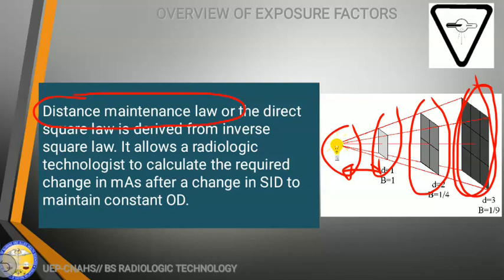So, therefore, para hindi masyadong maitim yung radiograph, a-apply na natin si distance maintenance law, which means we are going to reduce the mAs to compensate the intensity kasi nga malapit siya masyado. So, we are going to reduce the mAs para hindi sunog. Okay? So, para lighter din naman yung image. Nakuha po yung application ng inverse square law at saka distance maintenance law. Sige, so you can raise your question din naman through our different platforms if you have time. So do not hesitate po.